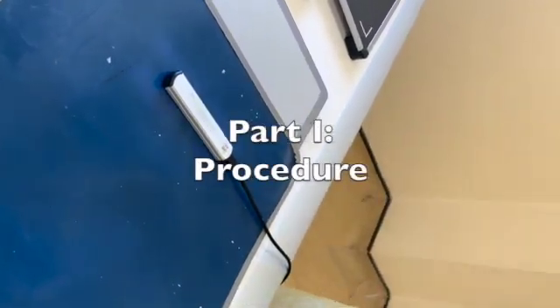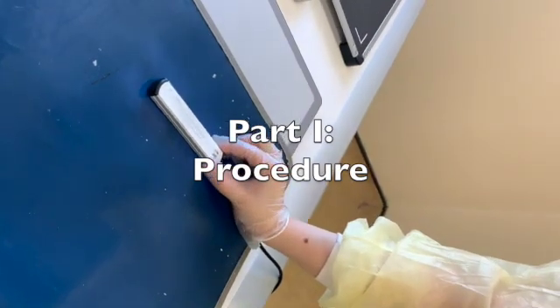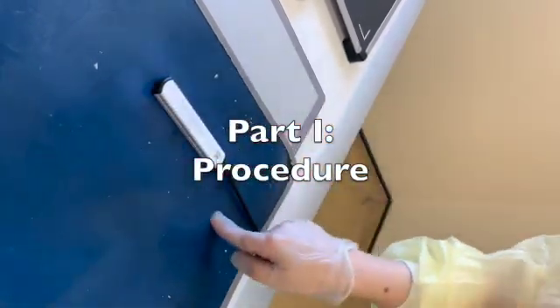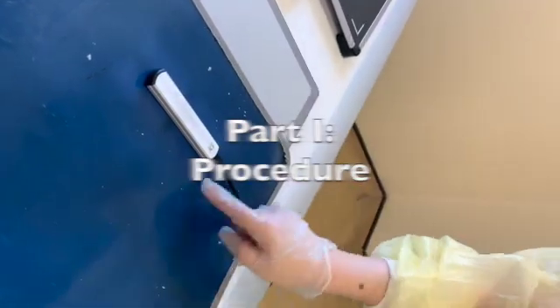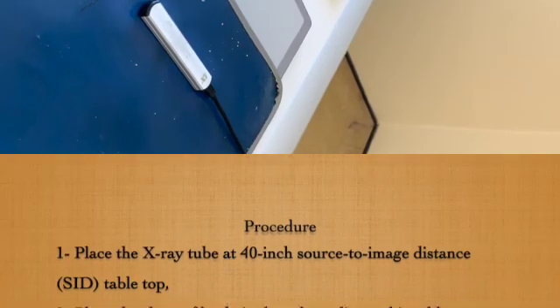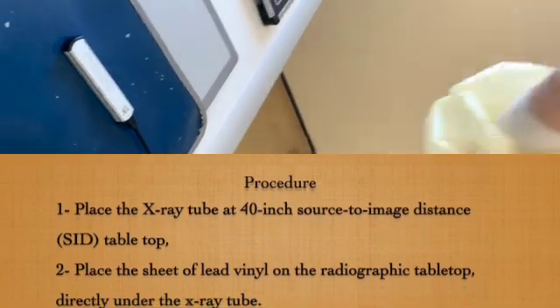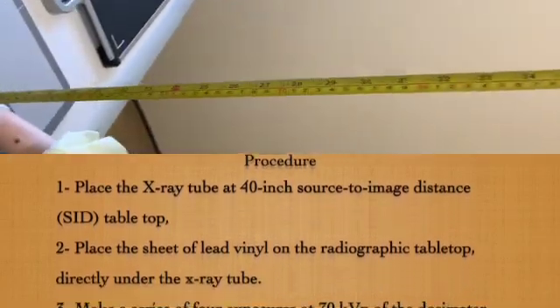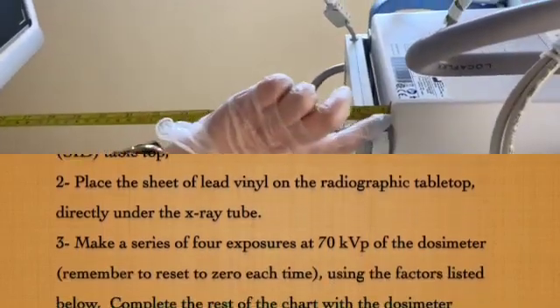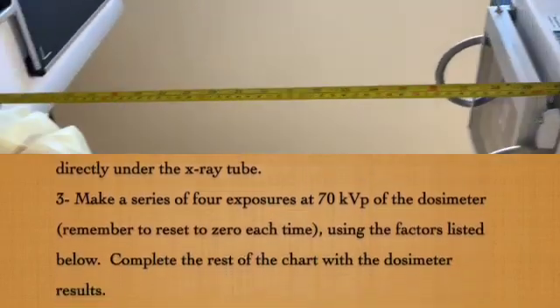What we do first is we set up our dosimeter with the minimum collimation to reduce the scatter as much as possible. Then we make sure the distance is about 40 inches, as you can see here, from the dosimeter.